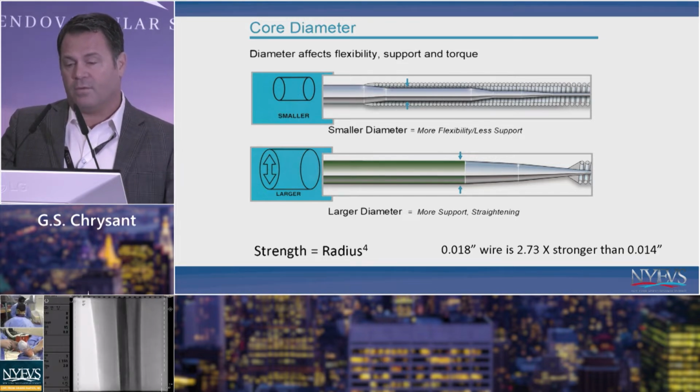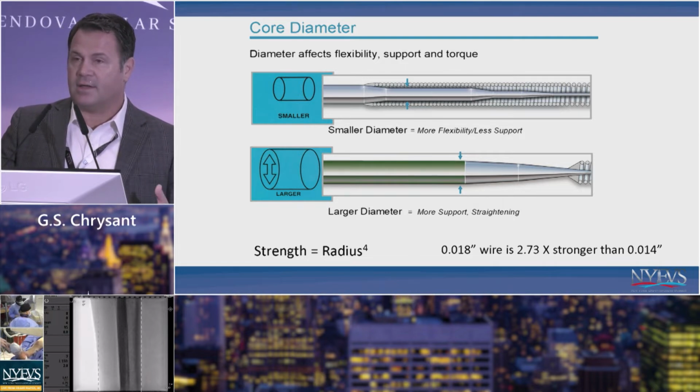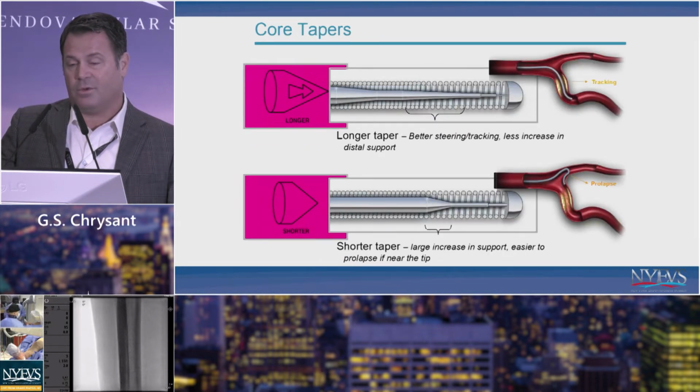When you go from an 014 system to 018 system, it's not 1 + 1 = 2, it's actually nearly 3 times stronger. And like I said, I think you'll find that the current variety of 018 wires is quite good. They're quite responsive in terms of tactile feedback, and they give you a lot of support and help you cross. And then finally, the taper of the wire.